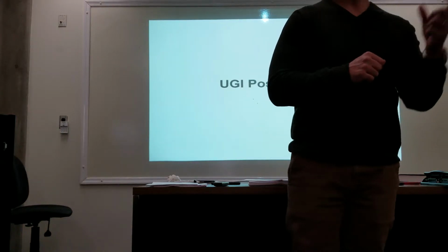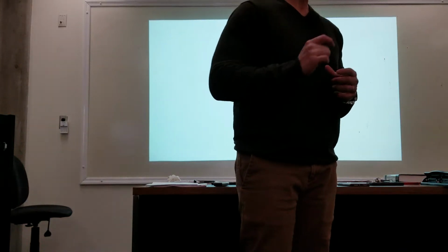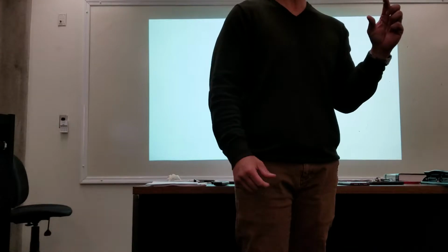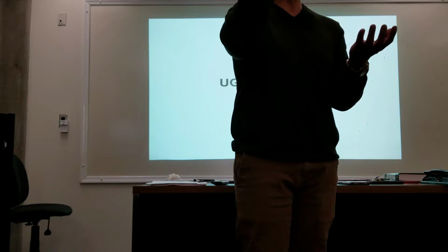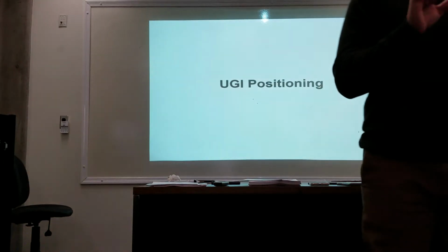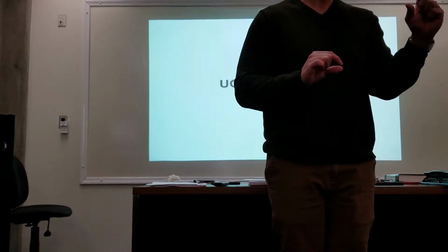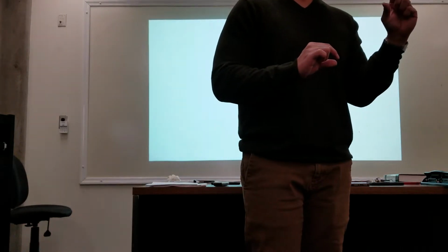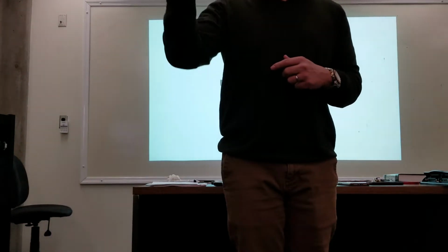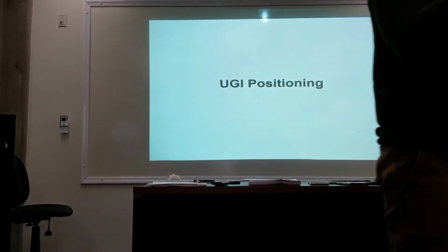These are the instructions. In the radiology department, you're going to have plastic shot glasses available, like 10 cc shot glasses. It's kind of like the same cups that you see when you're drinking NyQuil, those little cups. You're going to fill up that small cup, anywhere between 5 to 10 cc's depending on what your protocol is in your hospital, with barium. And in the other small cup, you're going to dump all the gas crystals.